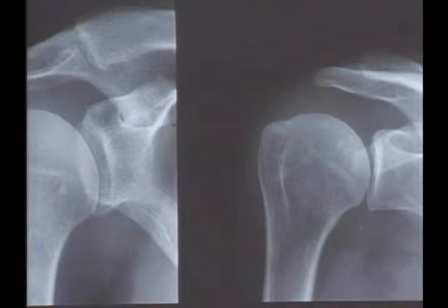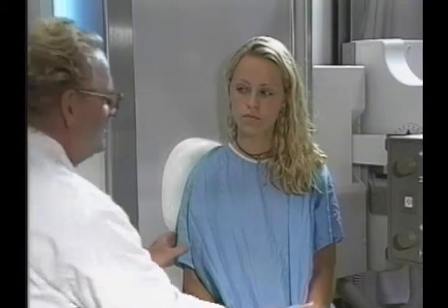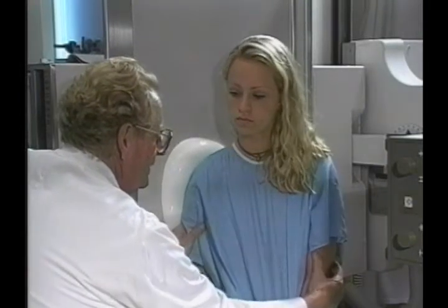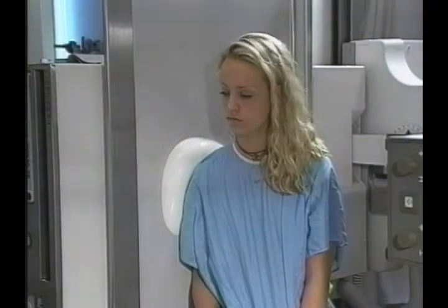The third variable is the aspect of the glenoid, which depends on the position of the trunk. The position already used showed an open glenoid as on the left. In cases of trauma, a New York surgeon, Dr. Neer, preferred a glenoid in true AP as seen on the right. To obtain this view, the trunk must turn to 60 degrees, but not the elbow, which must be repositioned.